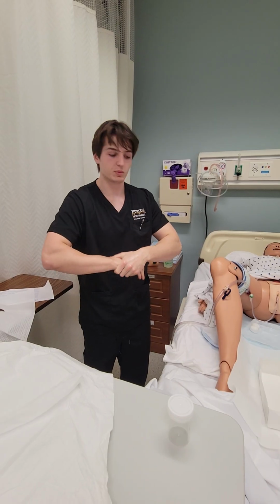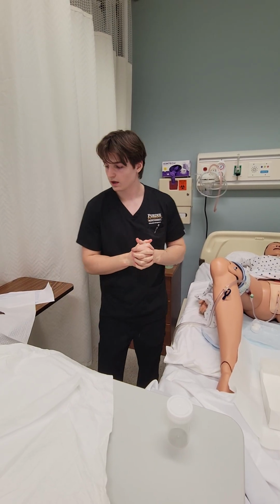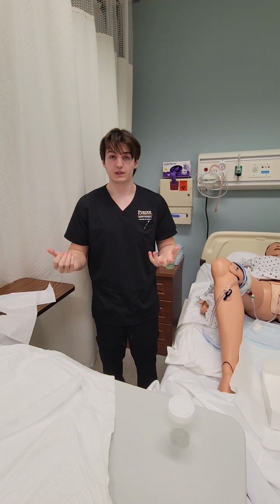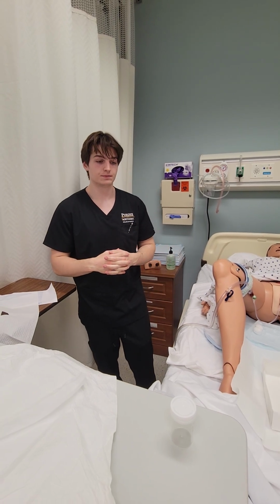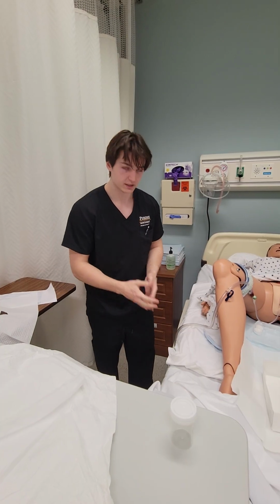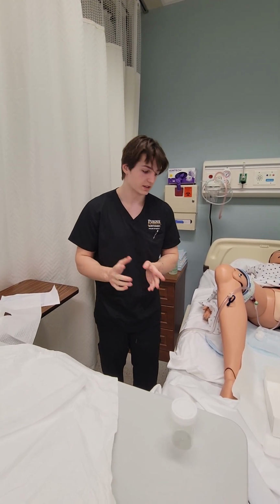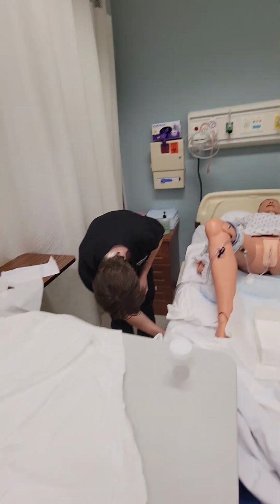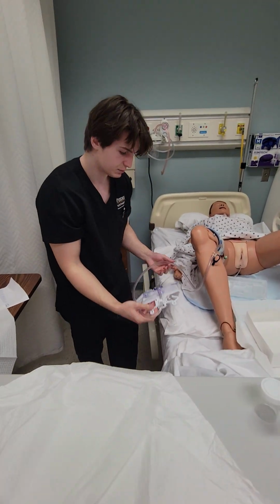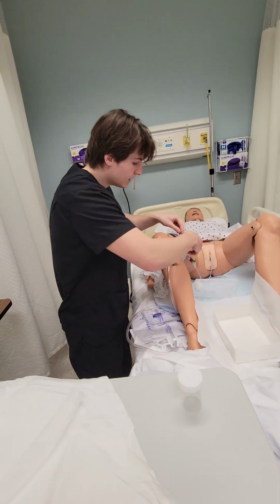So now we will be moving on to the section of removal. I did not have a graduated cylinder with me, but in a hospital setting or for test outs I would, and then I would drain urine out into this graduated cylinder, and then once this urine is drained, then I will remove this. I can just bring it up here for the time being because all this stuff is destined for the trash. Untie.